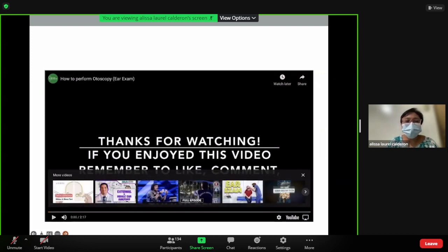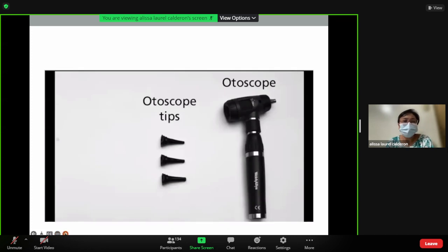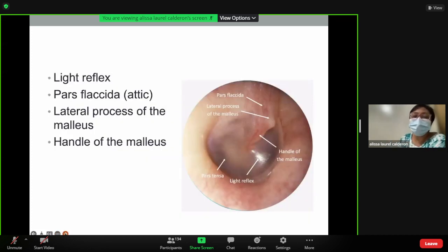So you've seen how he did it. These are the things that you need to identify when you do your otoscopic examination. First, you have to look for the light reflex. When you see this light reflex, it means that your tympanic membrane is okay, that it's intact. It means that there's no hole.